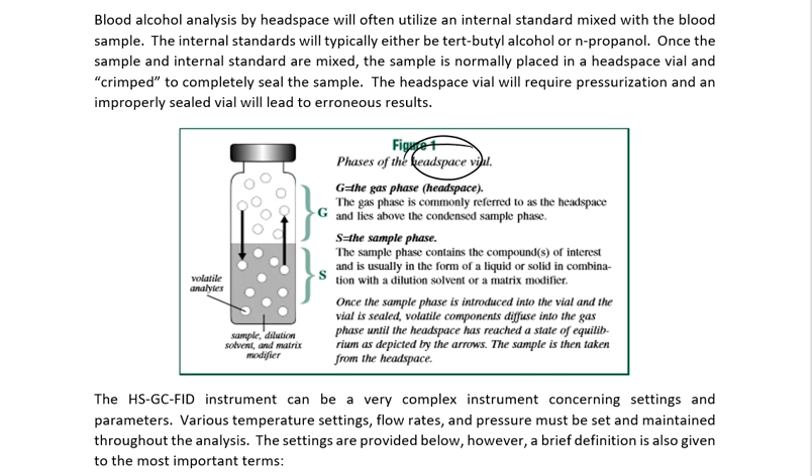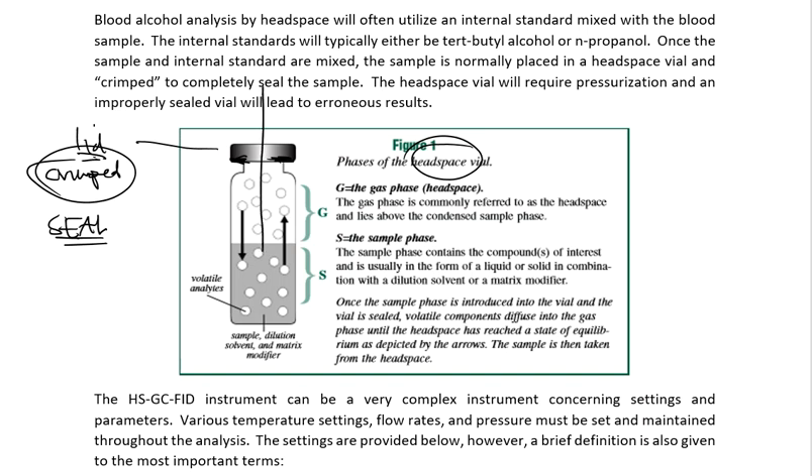What you're seeing on the screen right now is a headspace vial. It's glass, and on top is a lid that has been crimped. You take a crimping device, put it onto the metal lid, squeeze the handle, and it crimps that lid around the rim of the glass vial at the very top. That completes a sealed environment — completely sealed, nothing gets out, nothing comes in unless you puncture through the top. There is a rubber piece called the septa at the top, and a needle can puncture through that lid and go into your sample to extract what it needs.